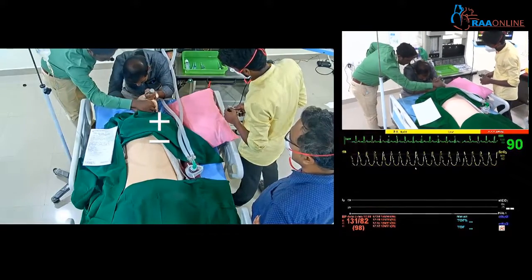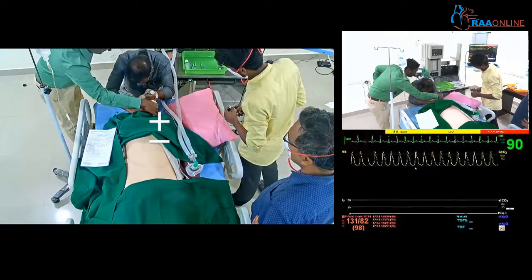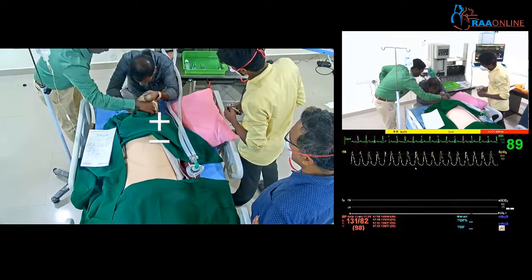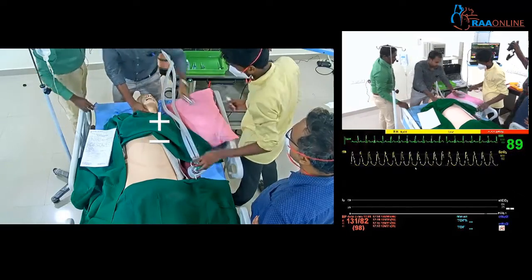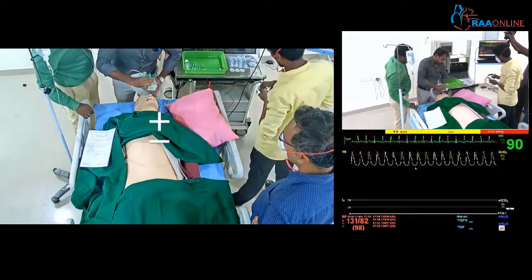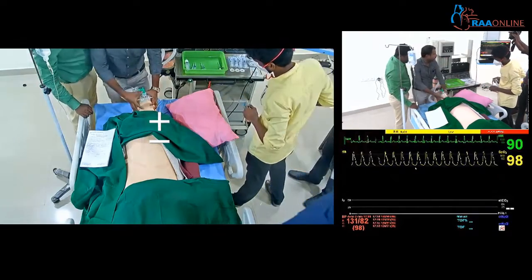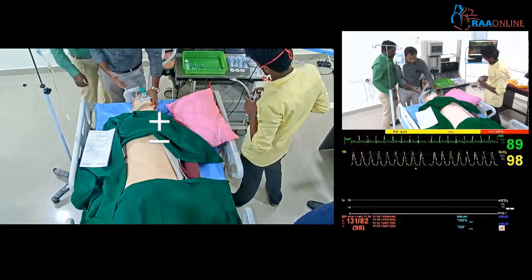Shall I give pressure, sir? Yeah, I cannot see anything. Okay, sir. Why don't you call somebody for help? How long are you going to keep doing this? No, sir. Just we will maintain oxygenation now. Am I able to please ventilate the patient? Okay, sir. Please ventilate the patient.